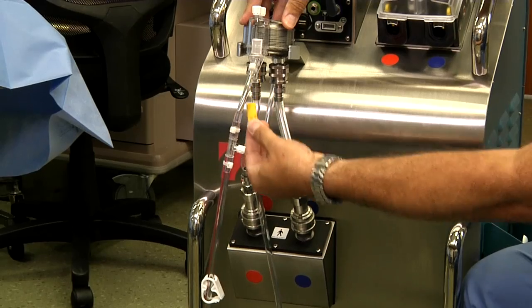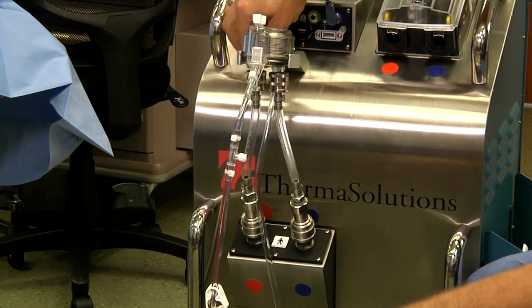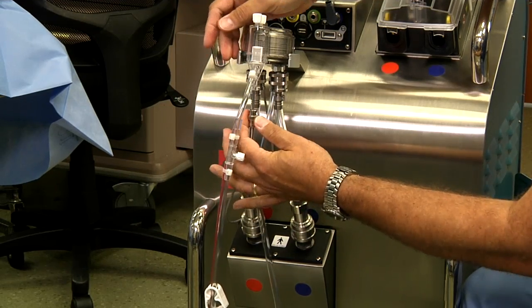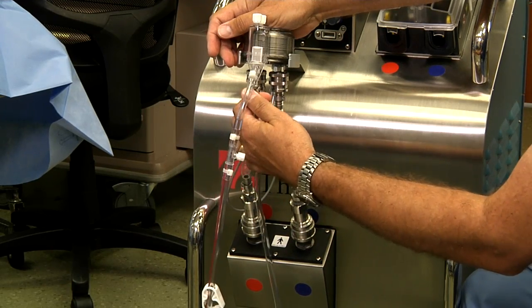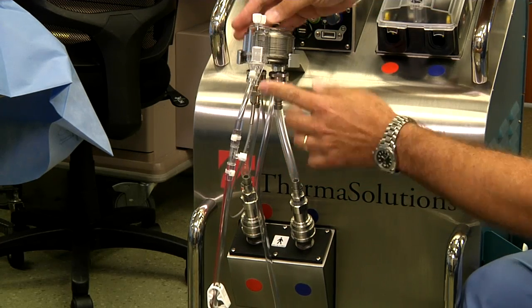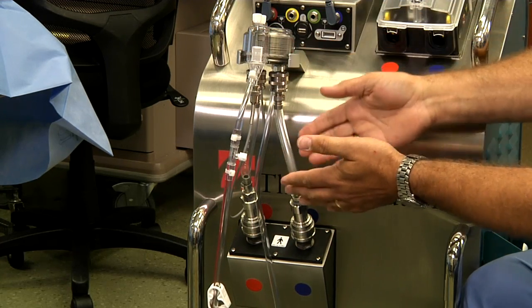The next component is removing the yellow cap. The gray heat exchange probe is inserted with a slight twisting motion to lock it in place. Now the heat exchanger is connected to the water bath.